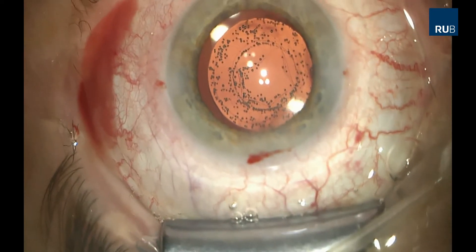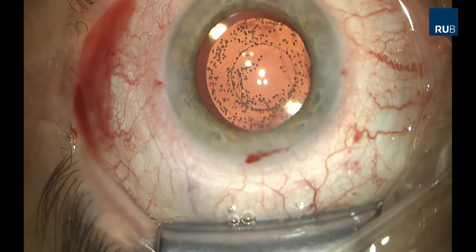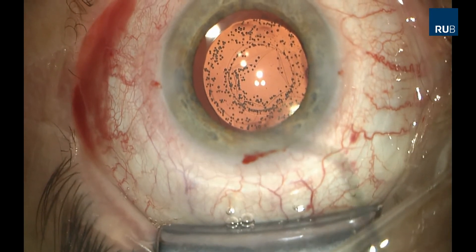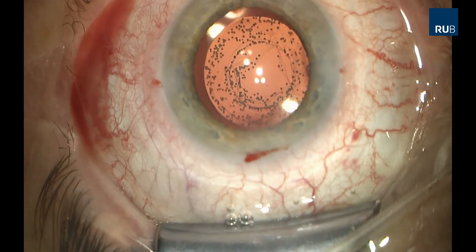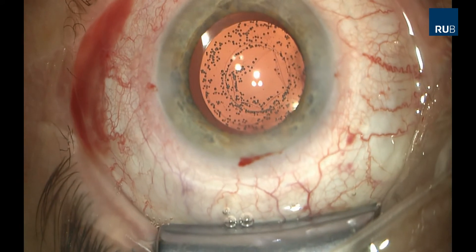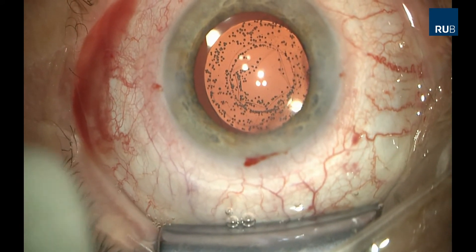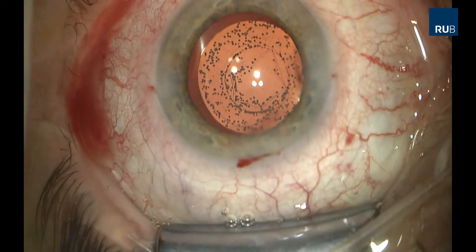Under the operating microscope the posterior capsule curls up and moves out of the optical axis. No further manipulations are necessary.